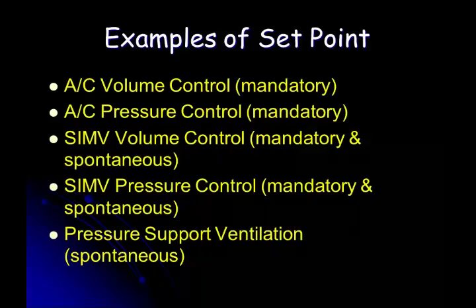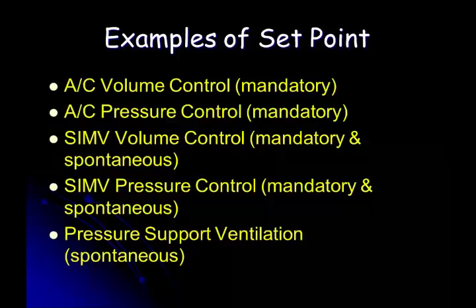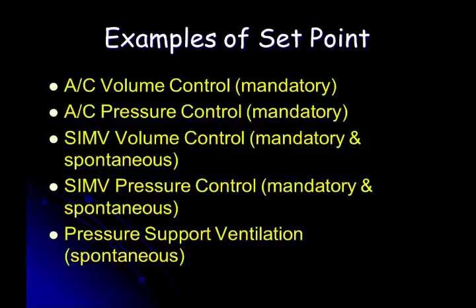Why would you want to use pressure? Because what do I fix when I fix volume? What other parameter is fixed? Flow. And we're going to find that that's a real problem. Because it's perfectly fine, a perfectly wonderful flow rate, when the patient comes out of OR and they're snowed. Now they wake up. And that flow rate may be totally inadequate.